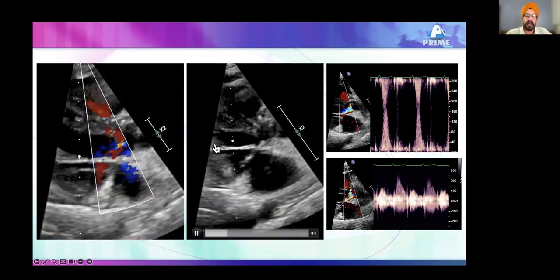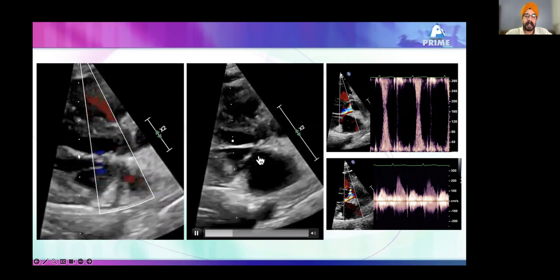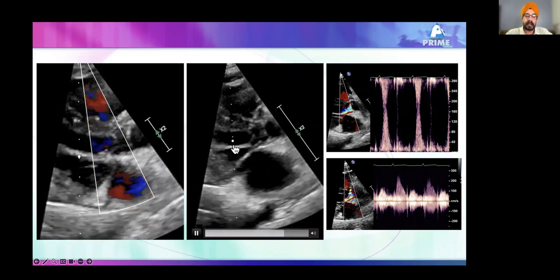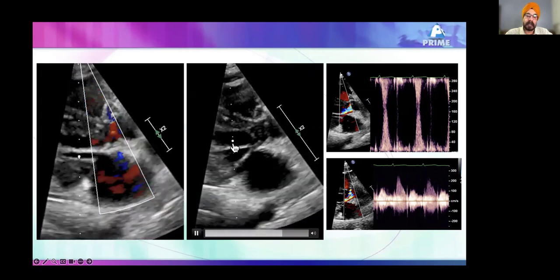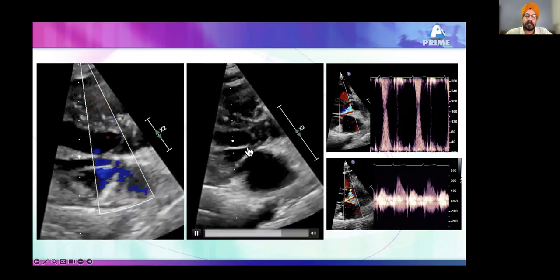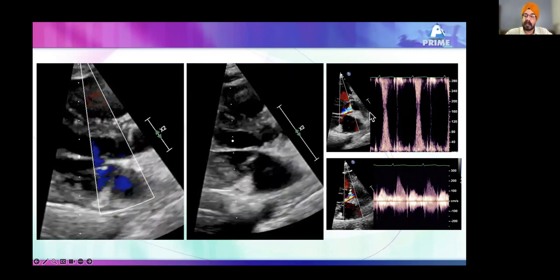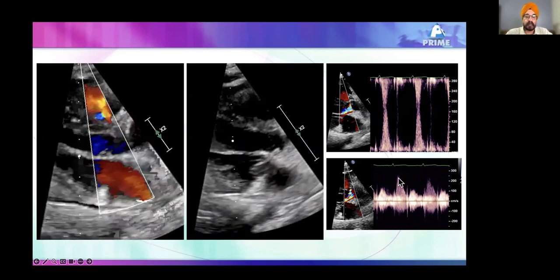The ligament is a kind of an accessory papillary muscle which is not attached by any chordae to any valve; it either goes and attaches to the mitral aortic curtain or gets attached to the interventricular septum here. In this case, it's attached to the curtain, and you see some gradient, nothing very great, a gradient of about 2 meters per second.